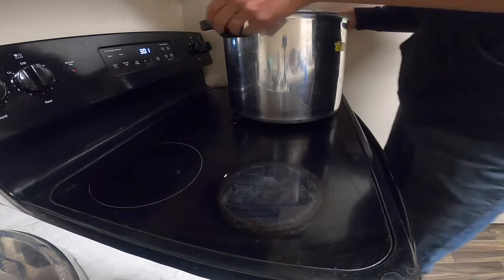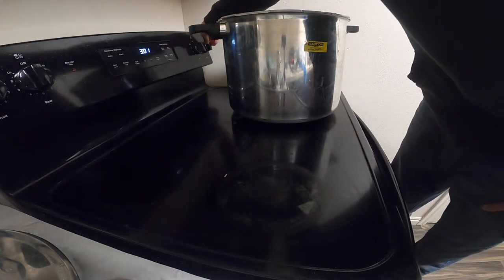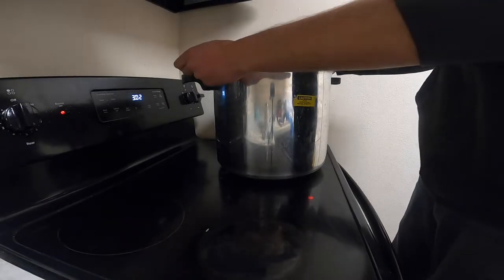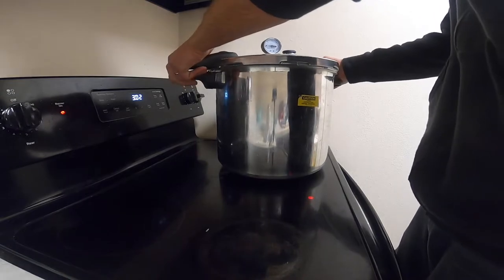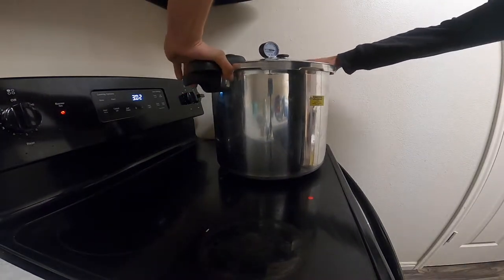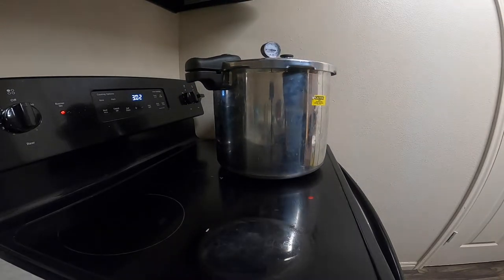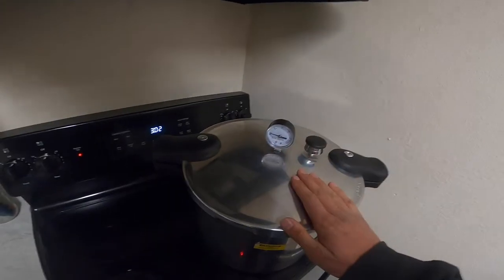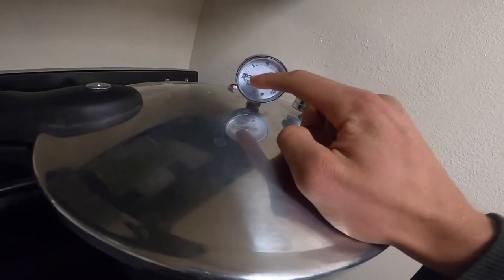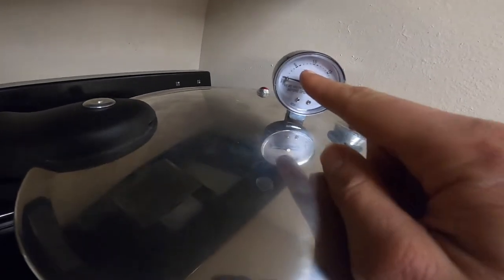We put our pressure cooker on the stove and go ahead and turn it on high. Put the lid on top, press down, and turn it so that it's sealed. Now we're going to let this heat up, and once we see that the gauge reaches around 10 PSI, we're going to turn down the heat a little bit so that it doesn't get too hot.